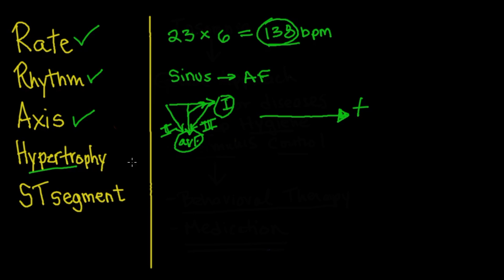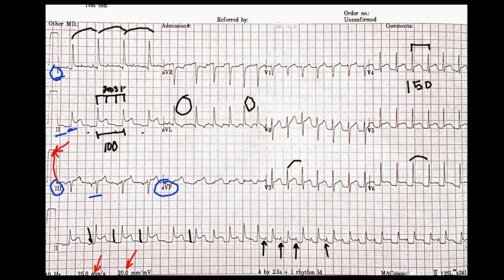Let's look for hypertrophy — it's tricky. There are four chambers: right atrium, left atrium, right ventricle, and left ventricle. For right atrial enlargement, we look for peaked P waves in lead II — we don't see that. In V1, we look for a large upward and small downward deflection — we don't see that either. For left atrial enlargement, we'd see a small positive and large negative P wave deflection — we don't see that. So no evidence of right or left atrial enlargement.